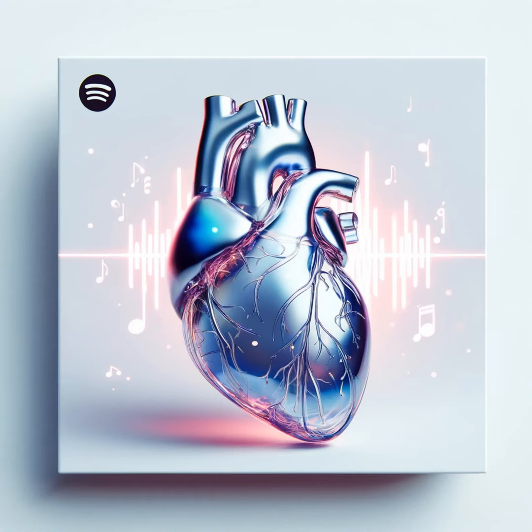Okay, so mild AR has a pressure half time more than 500 milliseconds. Severe AR has a pressure half time less than 200 milliseconds, whereas in the opposite direction, severe mitral stenosis has a pressure half time of 150 milliseconds. And again, MR and TR severity do not use pressure half time as part of the algorithm. Only aortic regurgitation does. Flail leaflet or poor leaflet coaptation points to severe AR and severe MR.